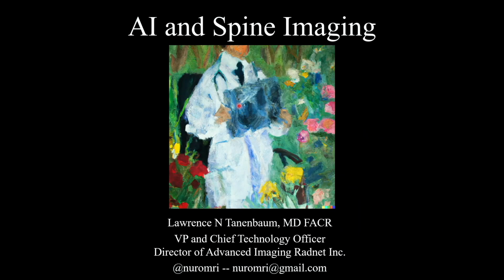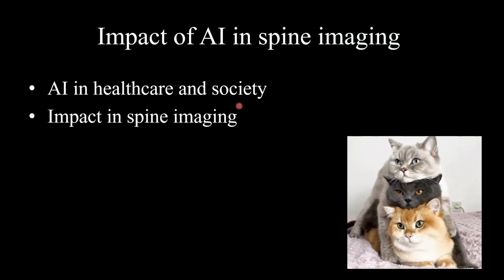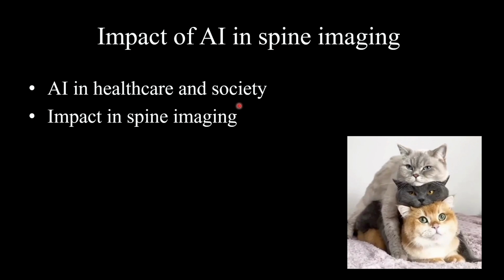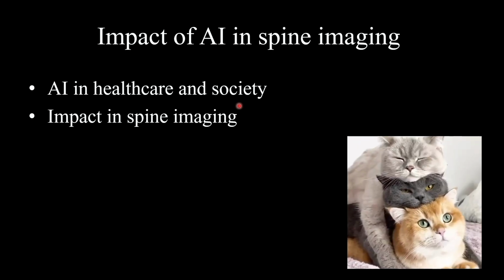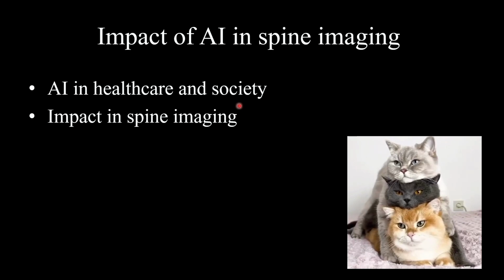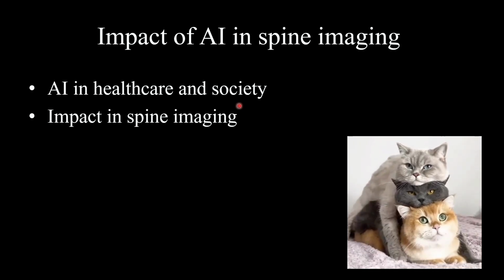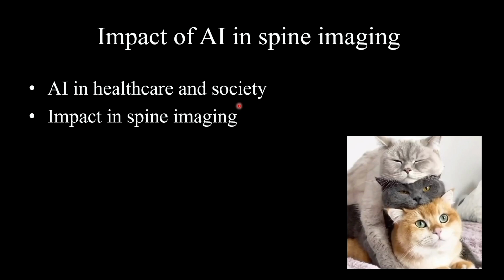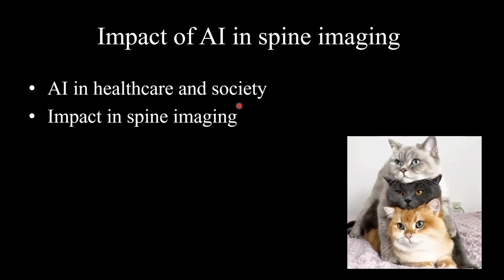injured. All right, so let's talk a little bit about where AI fits into the spine imaging sphere. We'll do a little bit of another introduction on AI in healthcare and society, hopefully mention some points that we didn't mention when I gave my AI and image reconstruction talk. But then we're going to talk about tools that are really available that you probably don't even know about that could make a difference on your spine imaging.